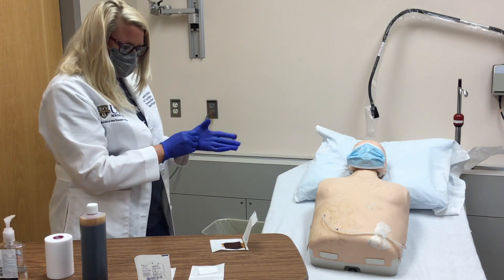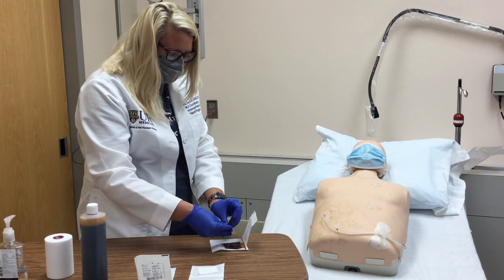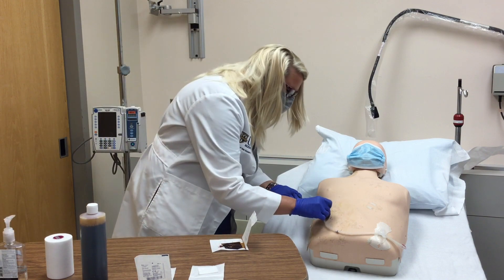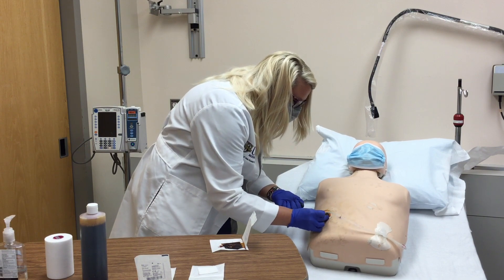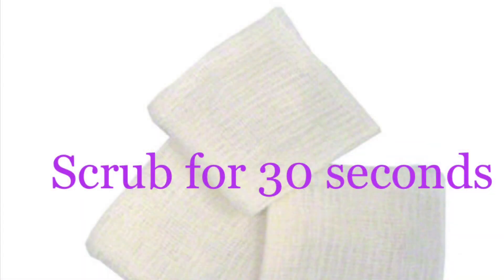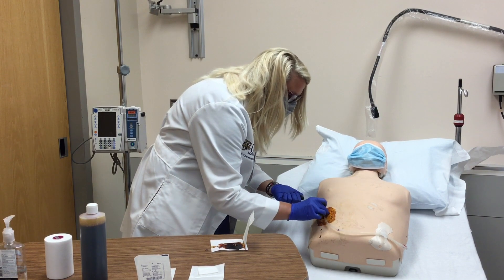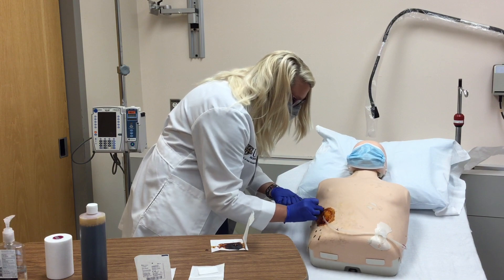Take one of the betadine soaked gauzes and starting at the exit site, scrub for 30 seconds using a circular motion. Go from the exit site outwards and include the driveline. Repeat with the second betadine gauze and allow to air dry completely.